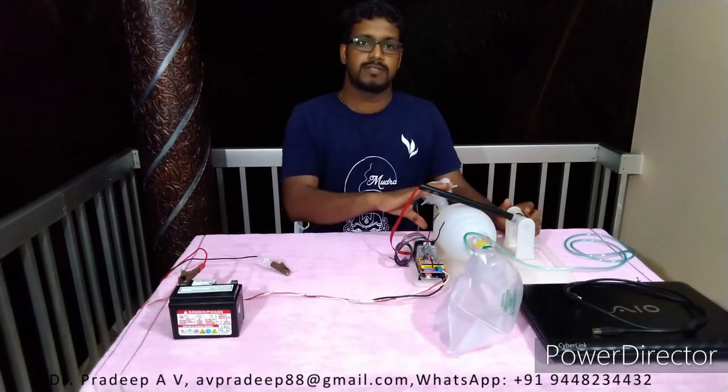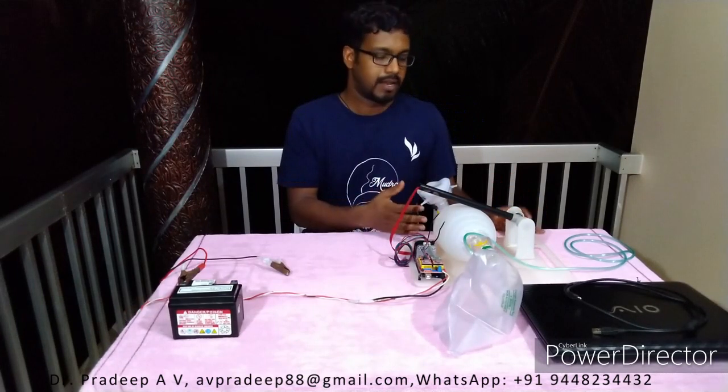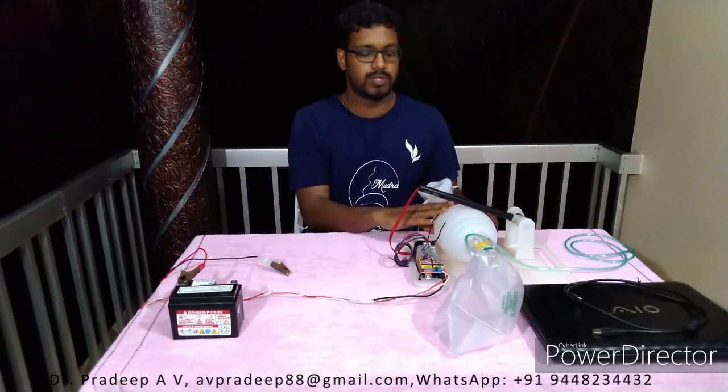This is not a perfect system. In case of emergency, we can use it and produce it in large numbers in a very short time, and that is the advantage of this.